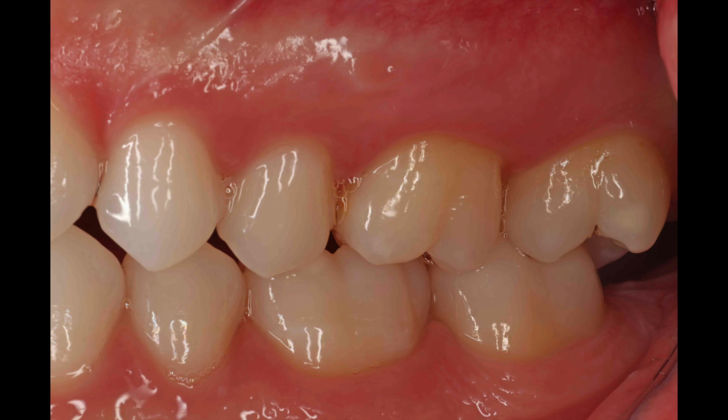As an aside, to minimize the amount of bubbles, like in this photo, remember to ask the patient to suck in air prior to the photo, or have your assistant dab the area with gauze prior to snapping, although sometimes it's unavoidable. Also, to decrease the amount of mirror fogging, soak the mirrors in warm water prior to putting them in the patient's mouth and ask her to breathe through her nose. If fogging still occurs, see if the assistant can blow light air on the mirror during the photograph.